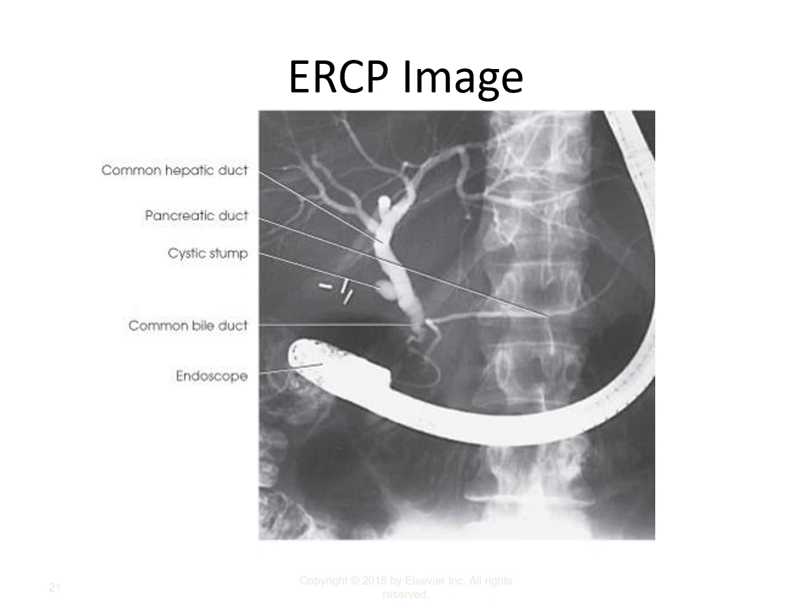So the patient may have had gallstones previously, but it looks like the dilation of the biliary system is starting to reduce. It's only moderately dilated with no dilation of the right and left hepatic duct. Those are actually normal size, as is the pancreatic duct. So only the common bile duct is mildly dilated.